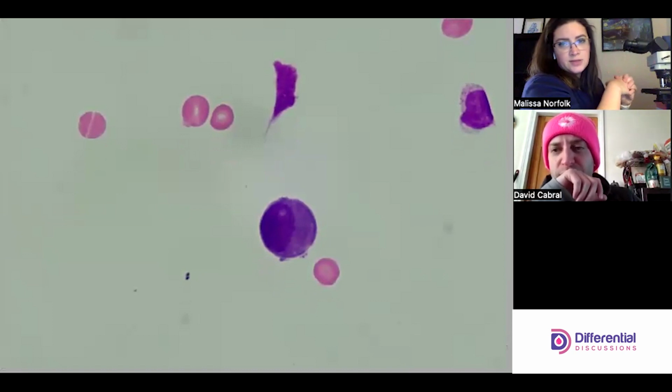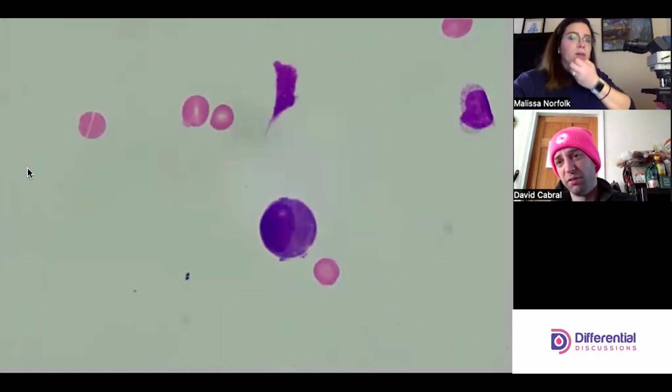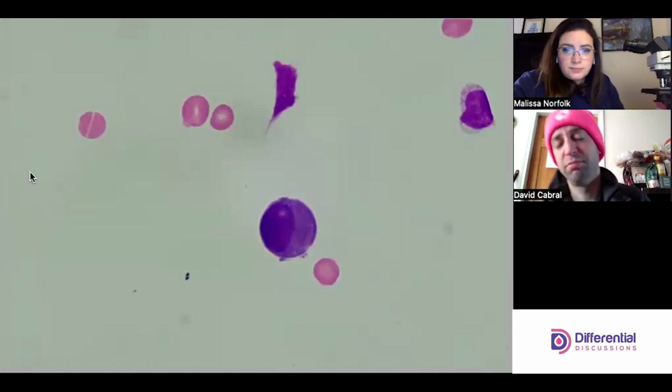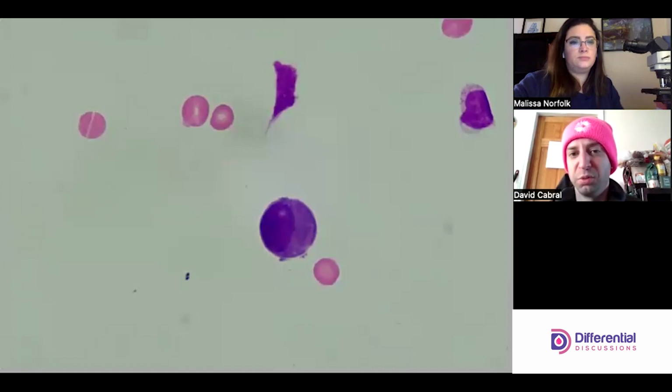So I think a meso is as good a guess as any. Little dark coloration there, but that supports some of the other presentations of our mesos. And it looks like there are some little blebs here too, which isn't unusual.